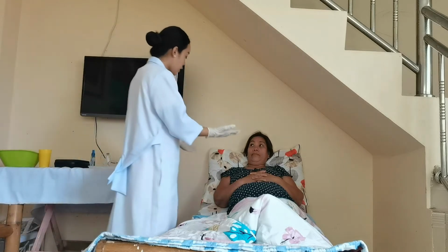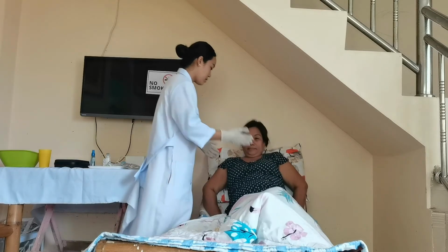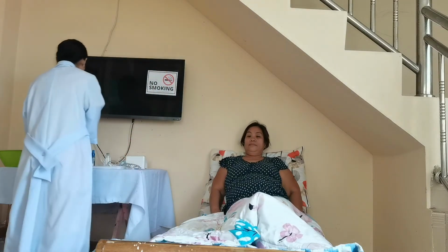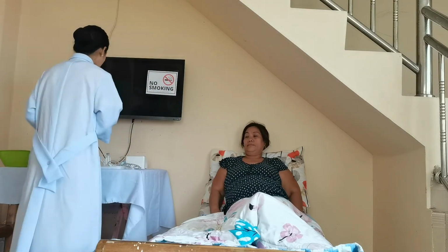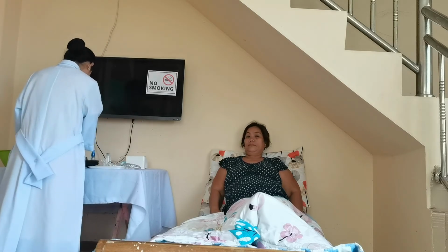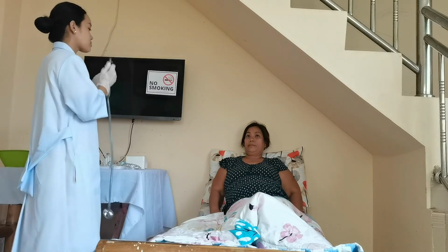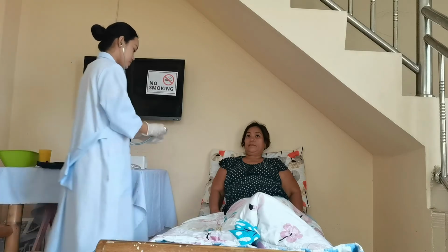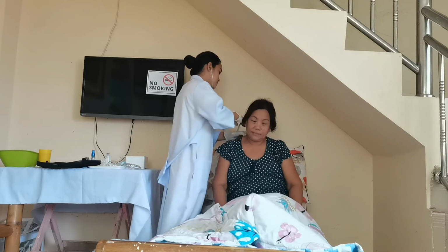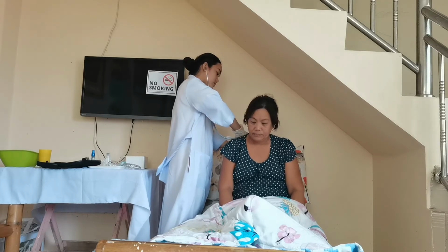So ma'am, okay lang po ba yung pwesto po ninyo? Hindi po ba kayo nahihirapan? Okay po ma'am. Okay po, that's good. So ma'am, bago po natin simulan, papakinggan ko lang po yung lungs po ninyo. Okay po? So, ma'am, pwede ko po ba pakinggan po yung likod ninyo? Tingnan lang po.